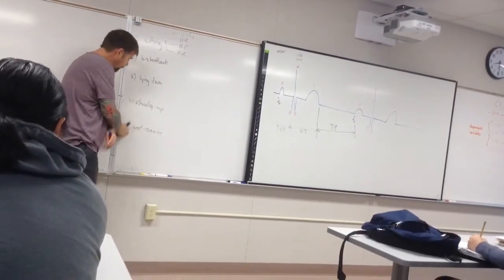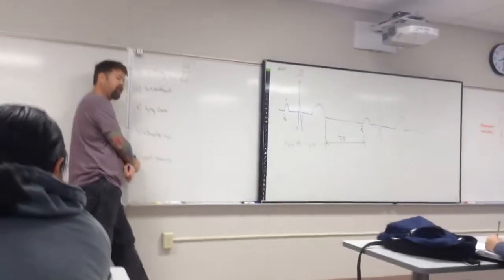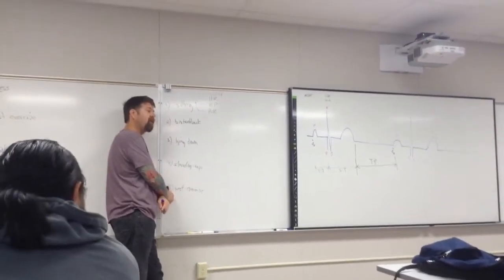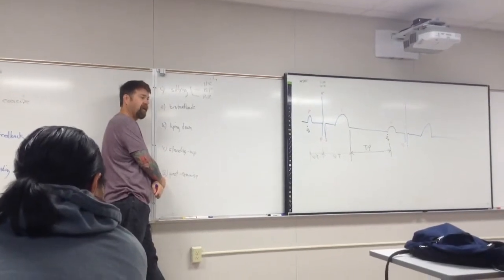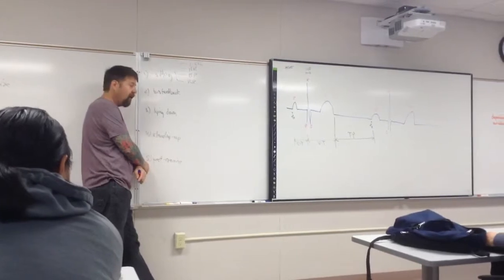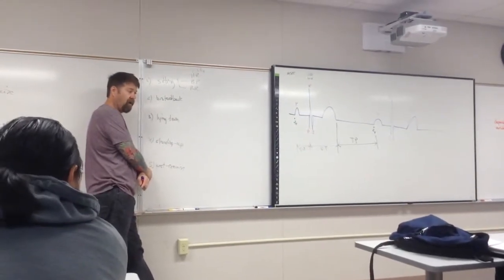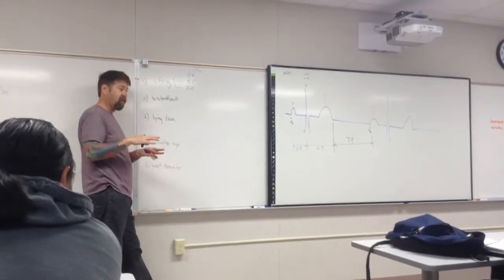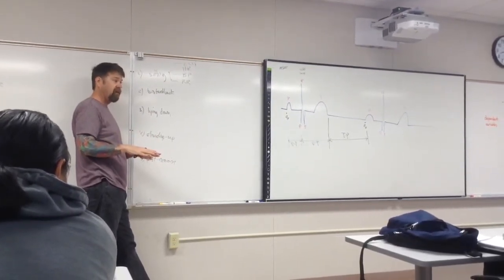And then I would do this one last, because for some of you, depending upon who the test subject was, if we did this first, your cardiovascular system won't be back to normal before the end of class, okay? Because you're not very fit. The more fit you are, the more rapidly your cardiovascular system will return to normal after a sympathetic response, right?